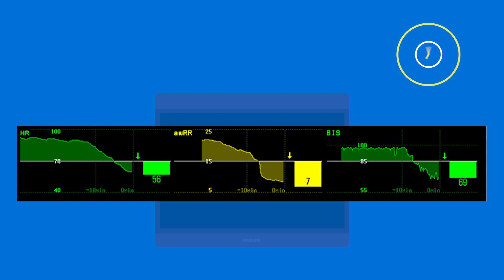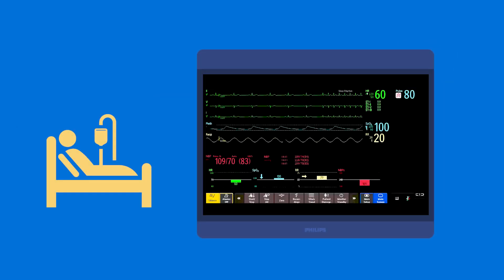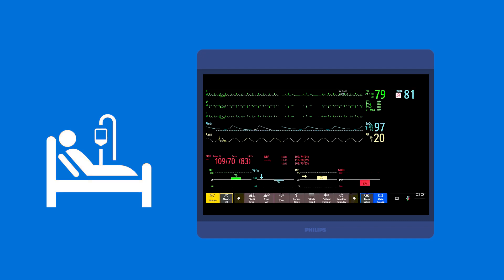An optional trend graph shows the measurements over the past 30 minutes to 12 hours. With one glance, you can see if your patient's measurements have been maintained within a set range, giving you a visual to indicate if the steps you've taken to help your patient have had the desired effect.